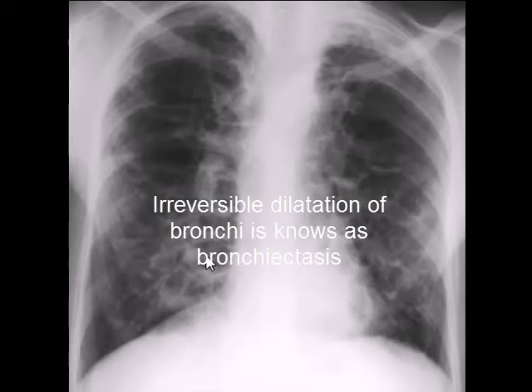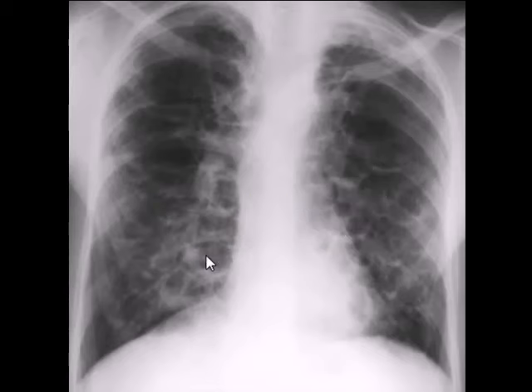Bronchiectasis by definition is a permanent and irreversible dilatation of bronchi. As a result of dilatation, bronchi lose their ability to clear mucus. Accumulation of mucus within dilated bronchi causes frequent infections only to worsen the condition of the patient.